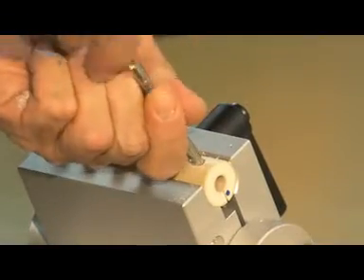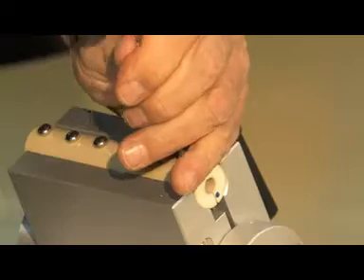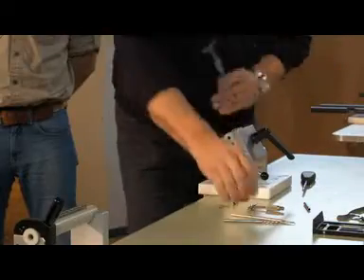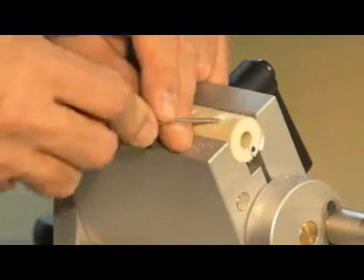I am removing some of the bone around the screw. The instrument is pushed firmly against the bone and rotated counterclockwise. If necessary, remove any debris around the screw with a sharp hook.